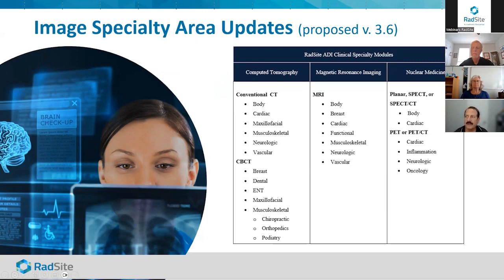Another difference is that in so many cone beam systems, for example, dental cone beam systems, you don't have a radiologist interpreting the study. You have the subspecialist. You don't have a technologist doing the study, but you have somebody that essentially does multiple things in the dental office that serves as the technologist. And you don't typically have a radiation safety officer already designated. And so those are really important distinctions. And of course, there are regulatory distinctions from one to the other. So even though they're both producing relatively similar cross-sectional images, there are really significant differences from one to the other.